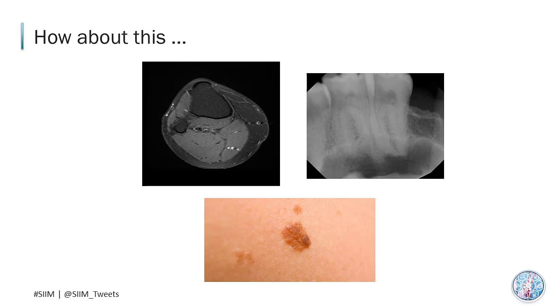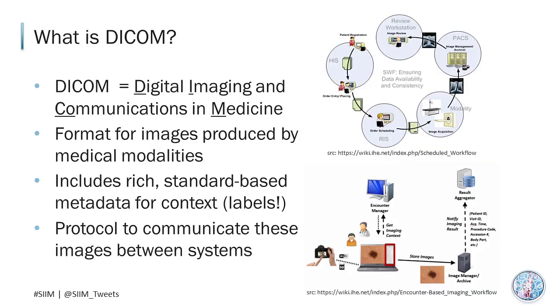Have you heard of DICOM, Peter? It's some sort of format for medical imaging, right? That's right, and more. First, it's an acronym for Digital Imaging and Communications in Medicine. It specifies the format that is used for capturing medical images. As mentioned earlier, there is lots of contextual information as well as content-specific data that needs to be captured.